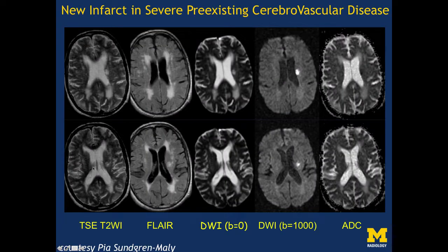So compared to normal MRI, there's a T2 weighted scan or one where we erase the CSF signal. Now we can look at the mobility of water in this low b image versus this high b image and actually compare these two to make a diffusion map. But notice we have this small infarct due to some vascular insufficiency here that produces this hyperintense signal that we would not easily see on the traditional contrast.